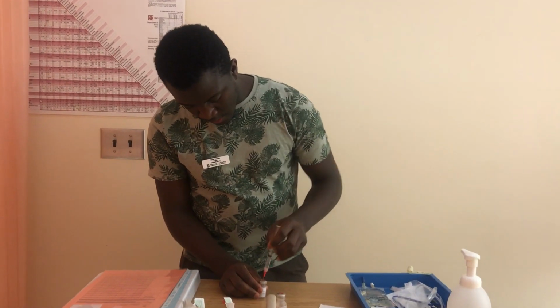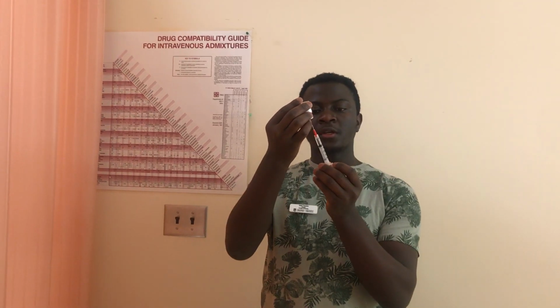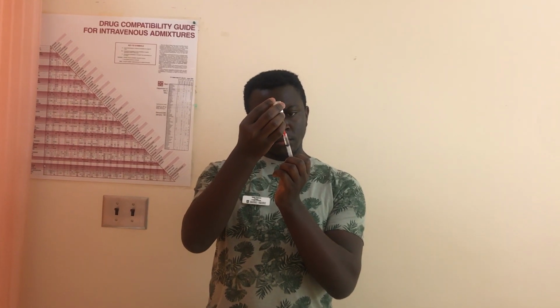I'll inject 1.2 milliliters of air and let the pressure fill in. I'm going to clean it quickly, just to ensure that after I rolled it, I didn't contaminate it again, for 30 seconds and let it dry for 15. Then I'll get rid of all bubbles.